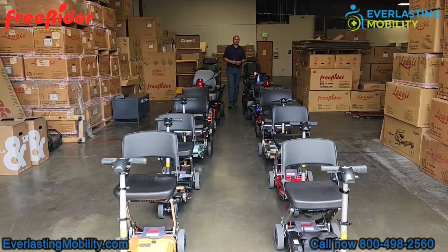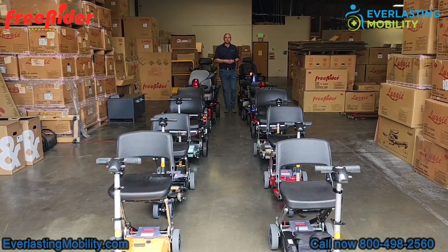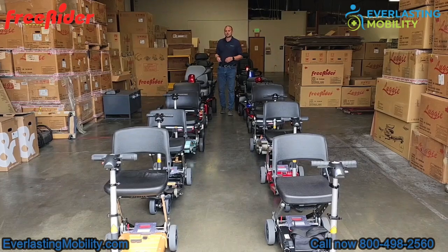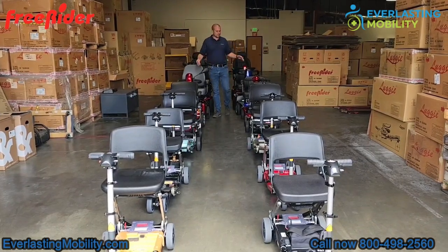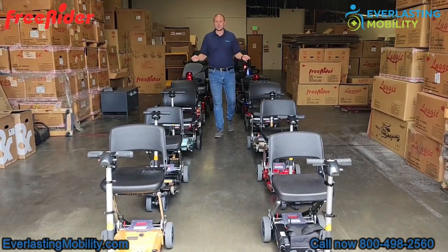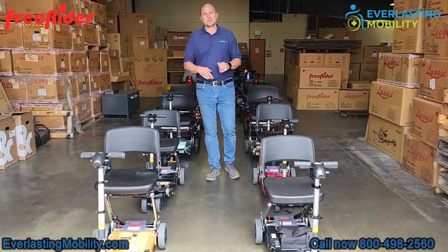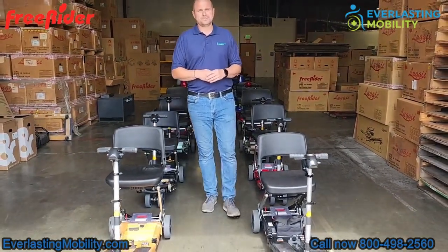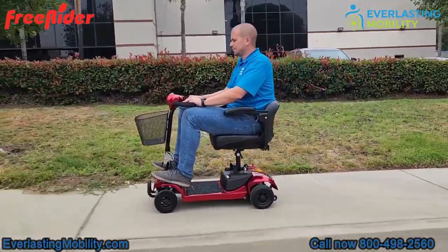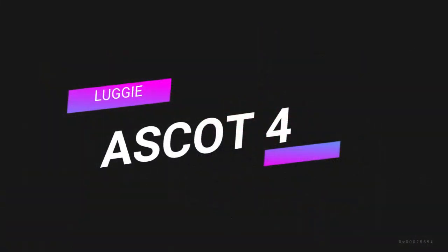Hi, this is Kel from everlastingmobility.com. We're visiting Freerider at their U.S. distribution in Rancho Cucamonga, California. They have a wide range of powered mobility products ranging from heavy-duty mobility scooters to mid-size to portable mobility scooters. They also have a few power wheelchairs and their world-famous Luggy folding mobility scooter line. In this video we're unveiling a marvel in scooter engineering: the Freerider Ascot 4 four-wheel mobility scooter.